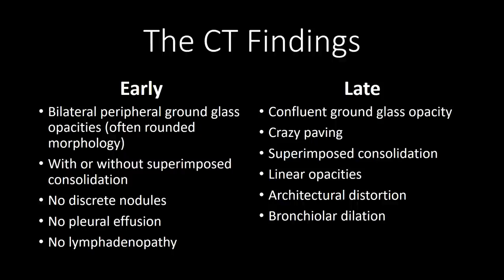Pleural effusions are not characteristic of the disease, and lymphadenopathy is not characteristic. As the disease progresses, the ground glass opacification tends to become more confluent. It often remains peripheral but can become more diffuse throughout the lung.